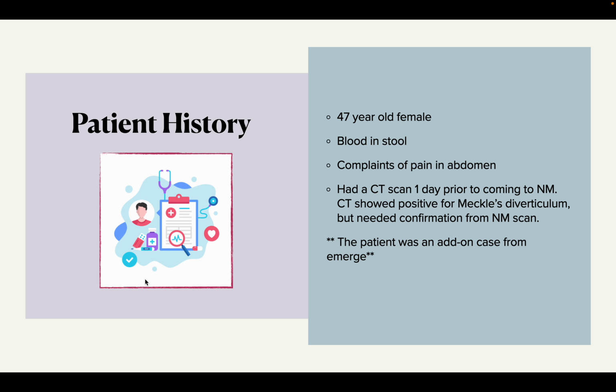So, patient history. This patient I had was a 47-year-old female. She came down because she basically had complaints of blood in her stool and pain in her abdomen. She had a CT scan the day before coming to Nuke Med, which showed positive for a Meckel's diverticulum, but the doctors wanted confirmation that it was actually this diagnosis with our Nuke Med scan, which can be a little bit more sensitive for this.